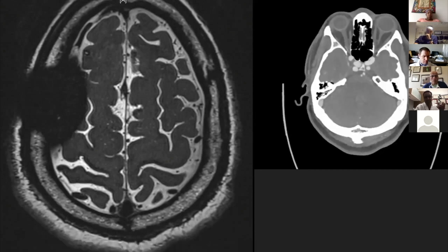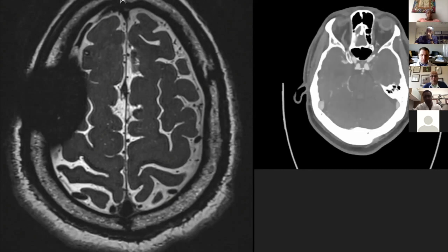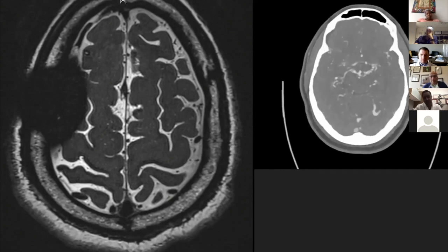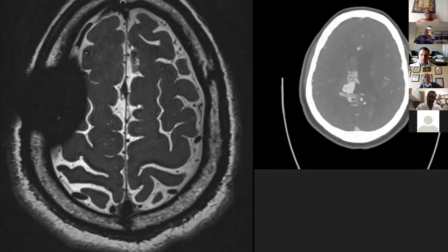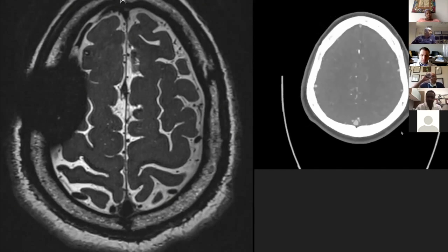That's a shunt that I placed preoperatively because he came in with hydrocephalus. One of the reasons I waited on this guy's case was logistics. There are rare but real episodes of vasospasm after certain cases, and I had a sense of that. I waited the 3 weeks, and also because you want to be ready, you want to have the right team.